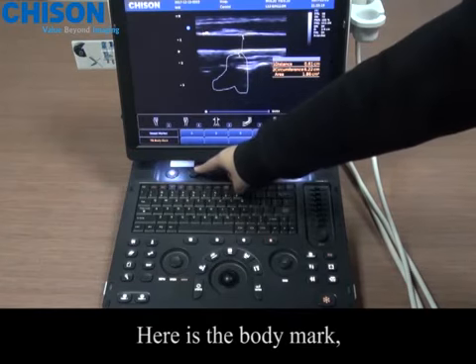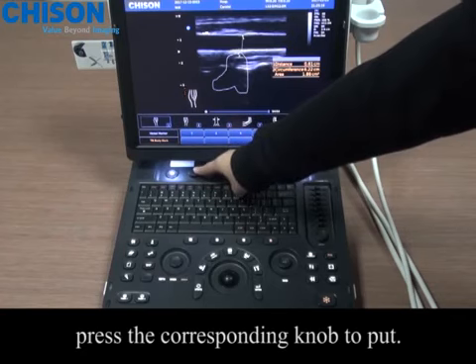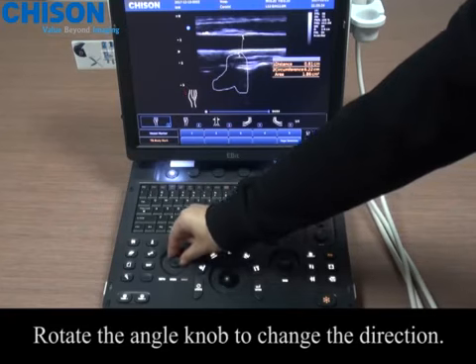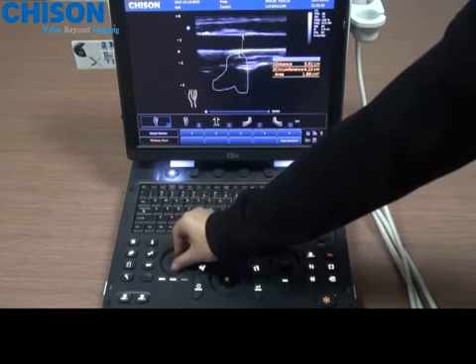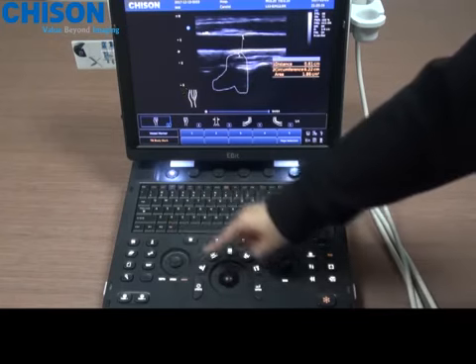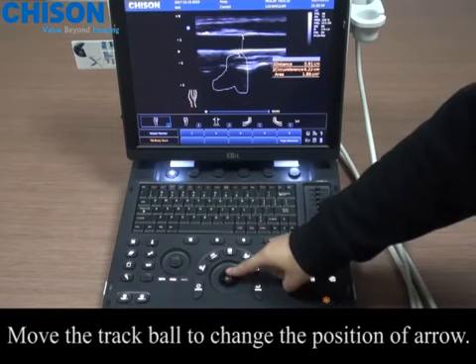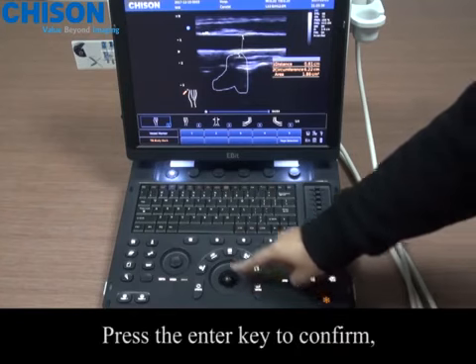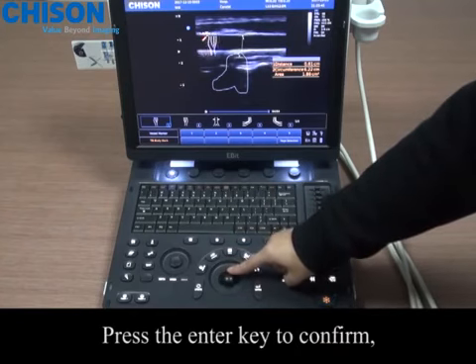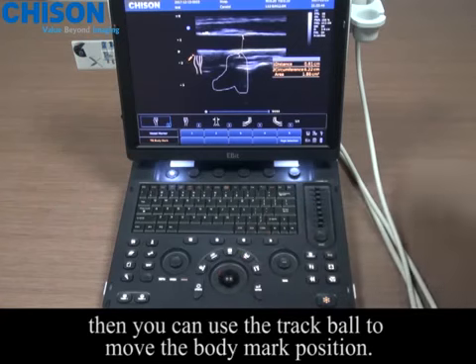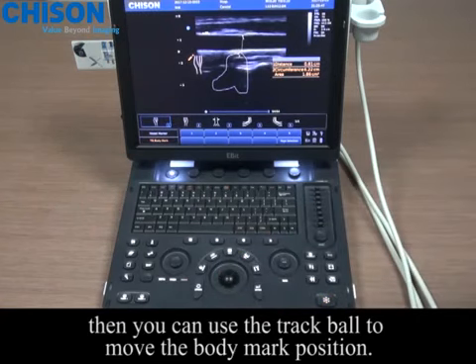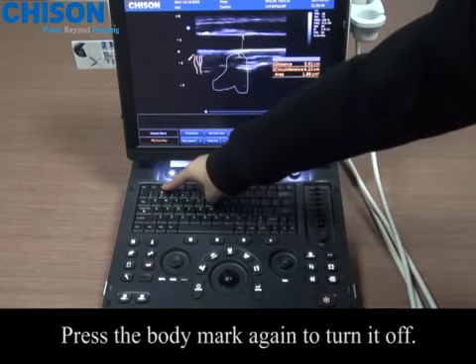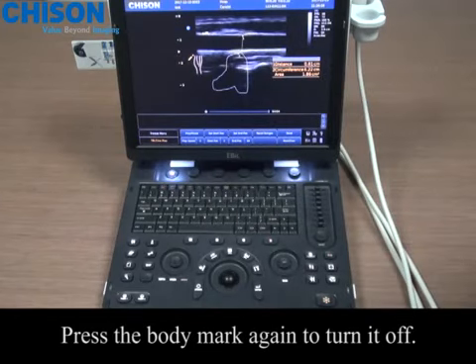Here is the body mark. Press the corresponding knob to place it. Rotate the angle knob to change the direction. Move the track board to change the position of the arrow. Press the enter key to confirm. Then you can use the track board to move the body mark position. Press the body mark again to turn it off.